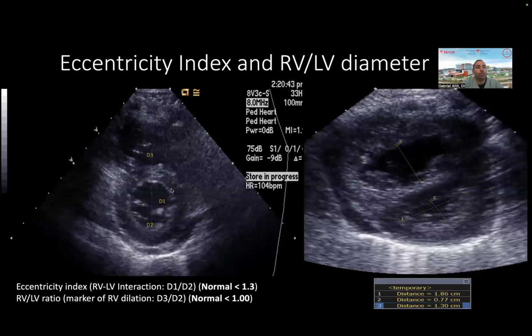So we can use some markers to quantify this septal deformation. I'll go for it. We're going to stop in 10 minutes. Is that okay? Yeah, you guys are okay? You're able to sustain the extra 10 minutes? No worries. So here, bye, Phoenix.